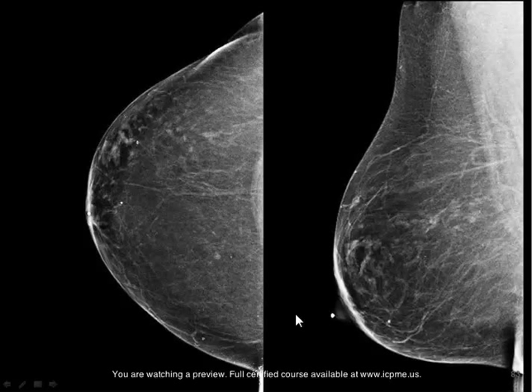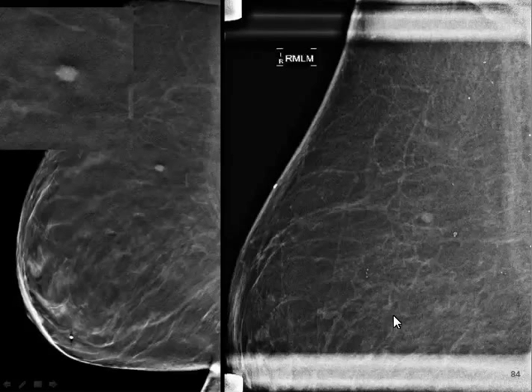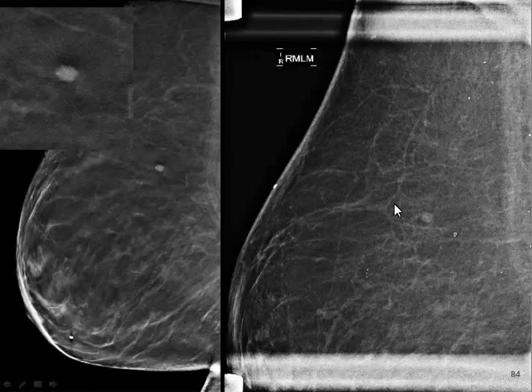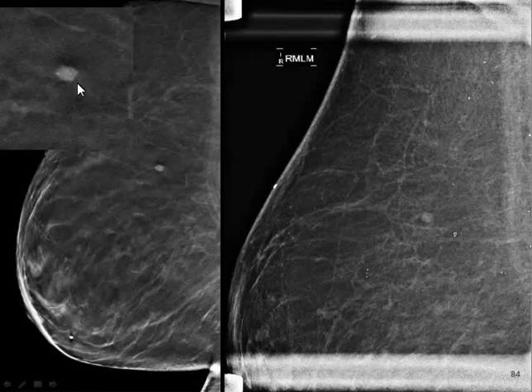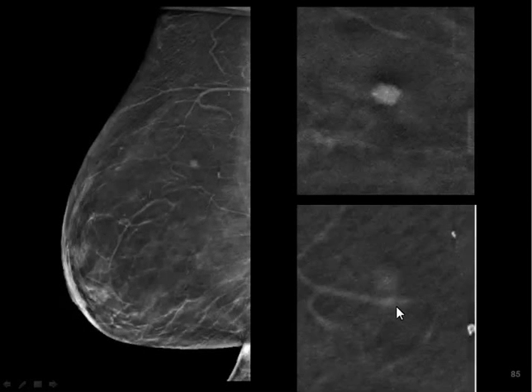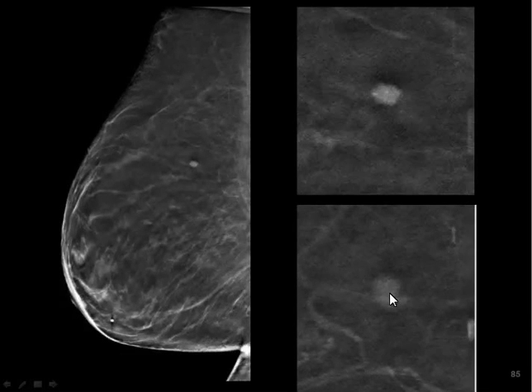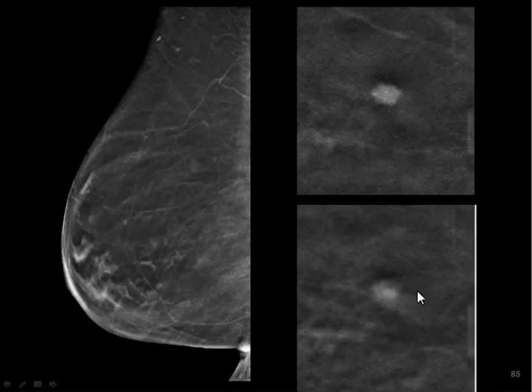This next patient also has a fatty replaced breast with a few scattered densities. Here's a spot view — does that spot view really help you? Not that much. But this tomo view helps quite a bit. What we can see is a high-density mass; although it's not spiculated, you can clearly see it has irregular margins. This is only a 4-millimeter lesion, and you'll see it in focus on maybe two images — it's a very small lesion.